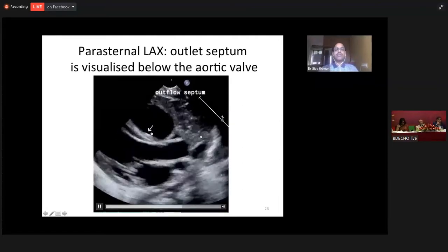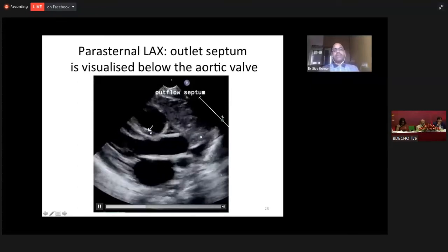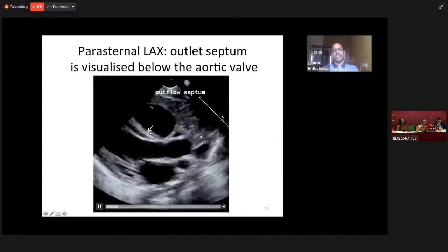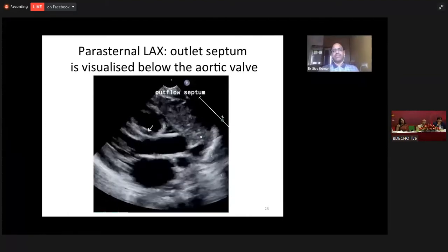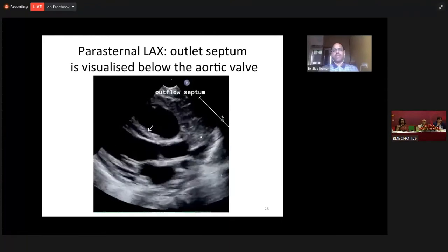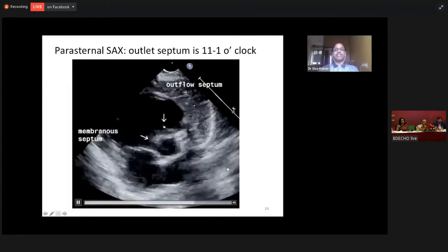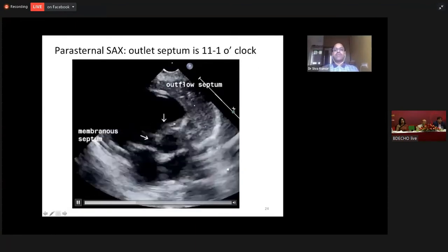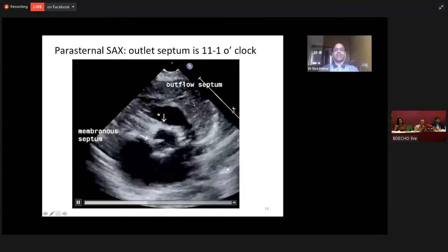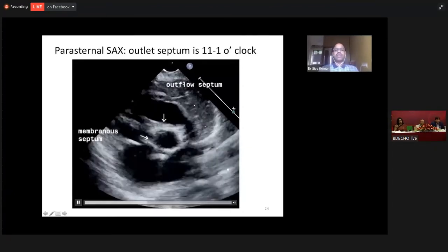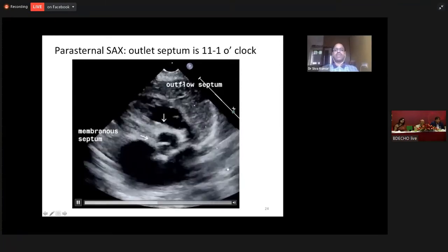This is the commonest form of ventricular septal defect in the oriental population. I am sure Bangladesh also has a slightly higher incidence of sub-pulmonic VSD. Most of the sub-pulmonic and outlet VSDs will be seen in the parasternal long axis view, immediately below the aortic valve. When you look at it on a short axis view, between 11 o'clock to 1 o'clock, whatever is anterior to the left ventricular outflow tract — this area is the outlet septum. Immediately below the pulmonary valve will be the sub-pulmonic VSD.